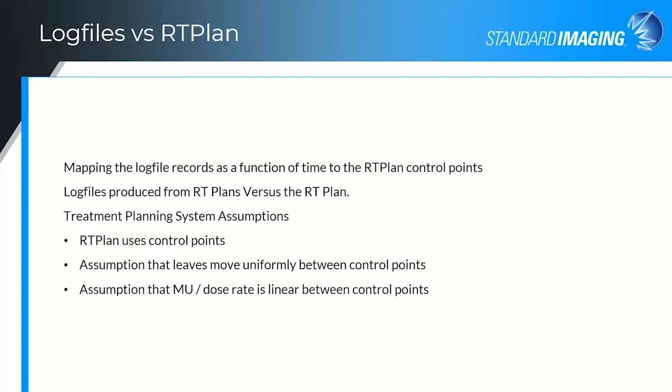This direct analysis is highly sensitive to catching errors, and I will touch briefly on some recent publications in this area later in the presentation.